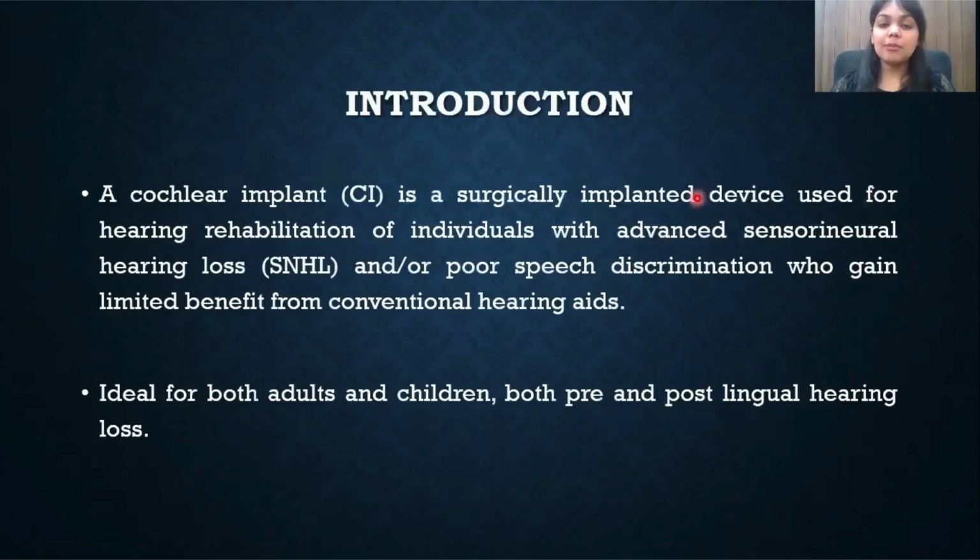It is a surgically implanted device used for hearing rehabilitation of individuals who have advanced sensorineural hearing loss and poor speech discrimination and who get no benefit from using a hearing aid. So it's ideal for both adults as well as children, for both pre and postlingual hearing loss.